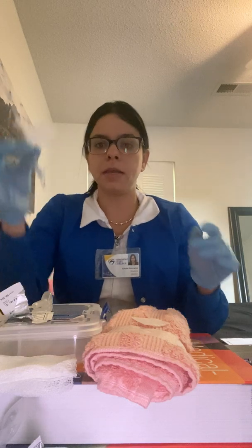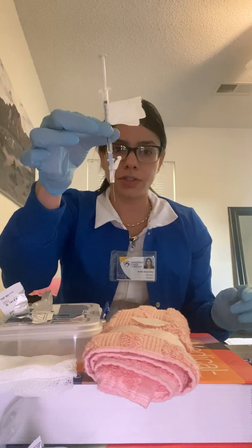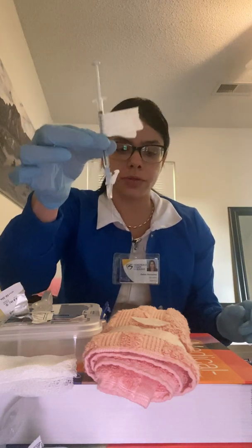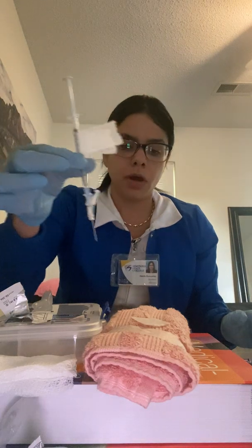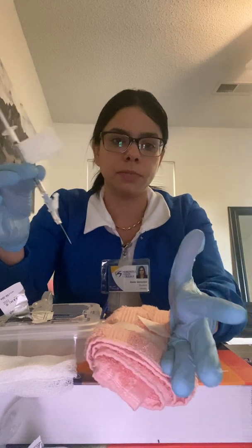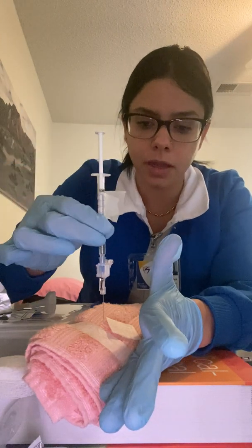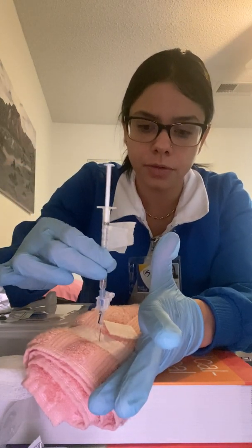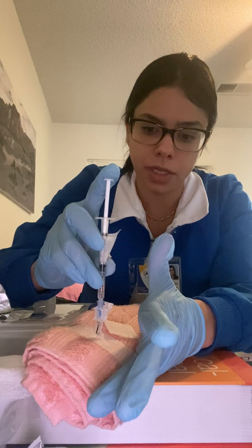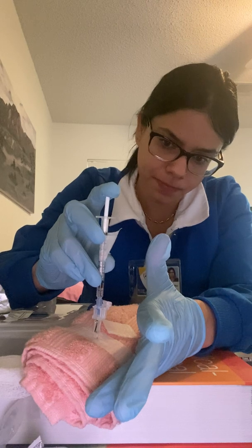Okay, and once more, I'm going to take my injection, my needle, and I am going to hold it as a dart. I'm going to go straight down as a dart, okay? I'm not going to think about it. I'm just going to go. If you go slowly, it might hurt, okay? So again, I'm going to use my non-dominant hand like this. Hopefully you can see where I'm going. And then I am going to inject. And then slowly, I am going to be injecting the medication.